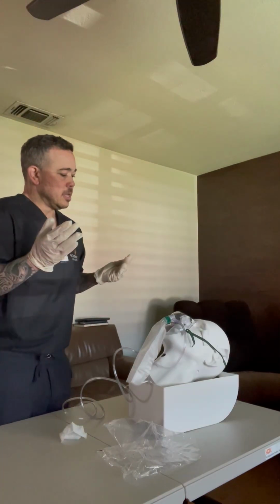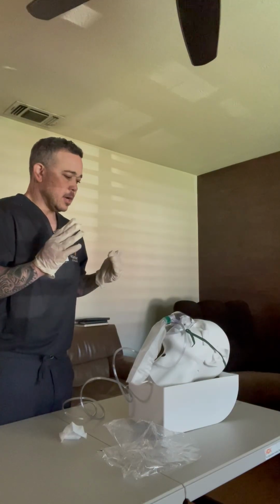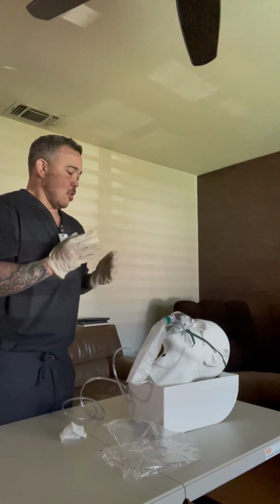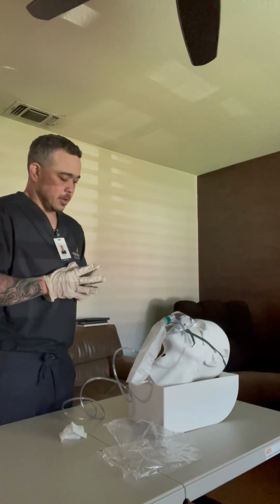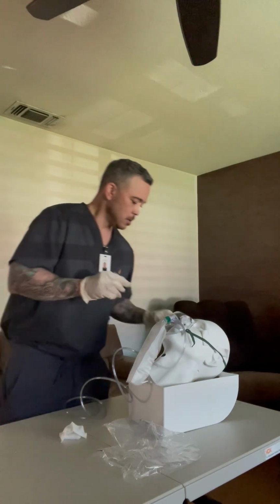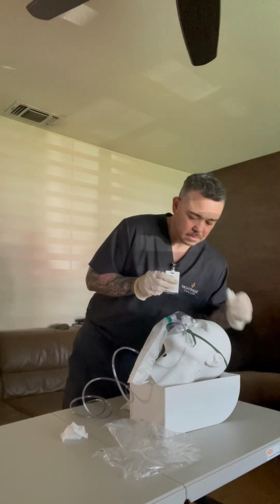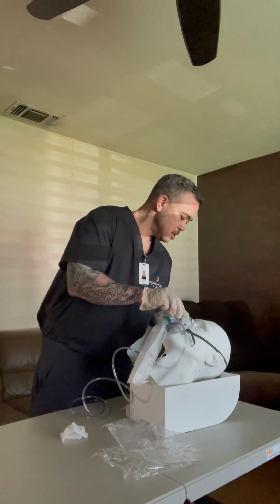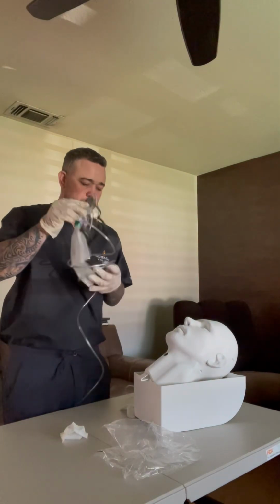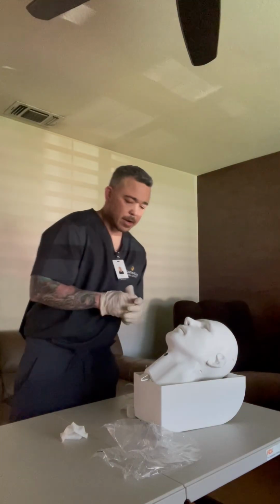Okay, so the doctor came in and stated that you no longer need oxygen, and that you're okay to quit the oxygen therapy, okay? So I'm gonna go ahead and remove that non-rebreather mask, okay? All right, so I'm gonna go ahead and take off the gauze. Okay, perfect. All right, I'm gonna go ahead and take off the mask, okay? Go ahead and apply this into the proper receptacle, okay? All right. Okay, are you comfortable, sir?